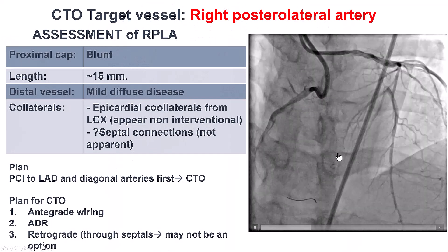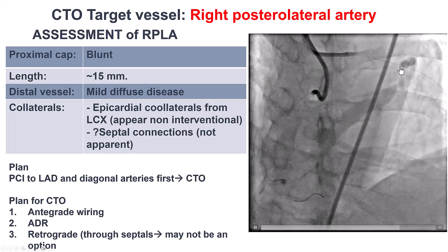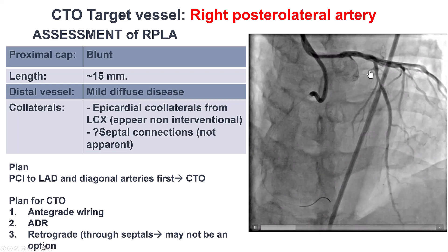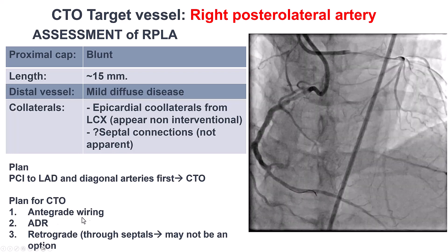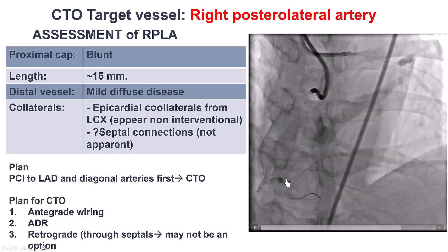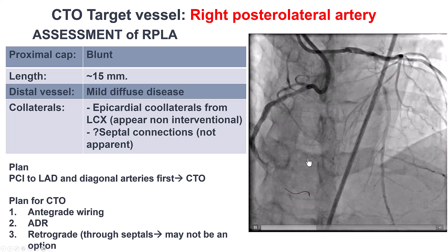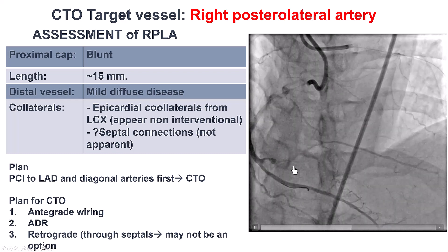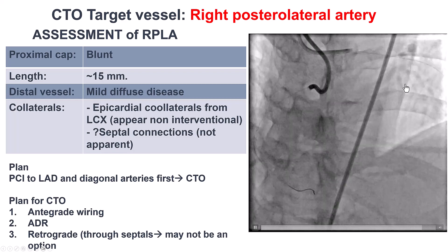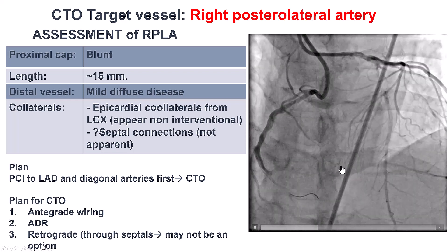How to approach these lesions? The consensus was to start with the non-CTO lesions to canalize the LAD and the diagonal, in part because of the possibility of going retrograde through the septals if antegrade failed. The CTO has a clear proximal cap and relatively short length. There is some diffuse disease on the distal vessel, and the collaterals seem to be mainly epicardial.